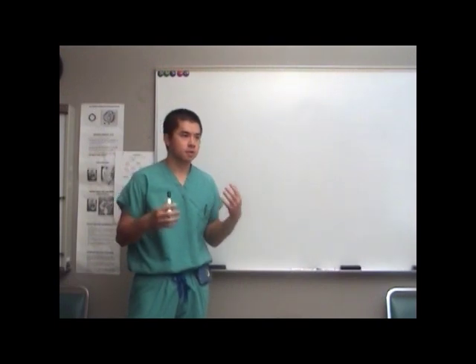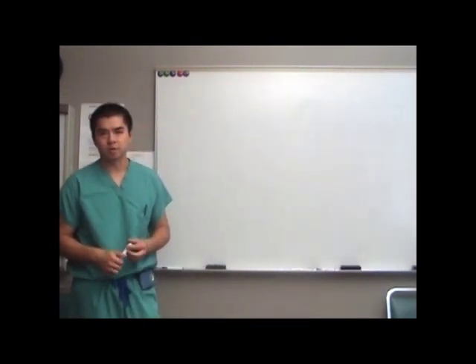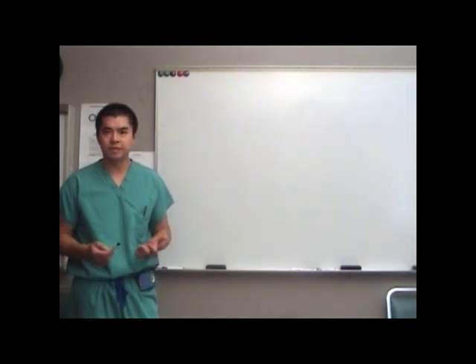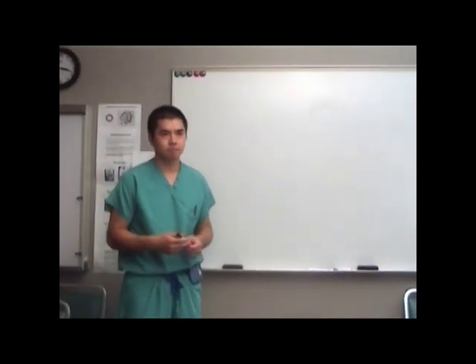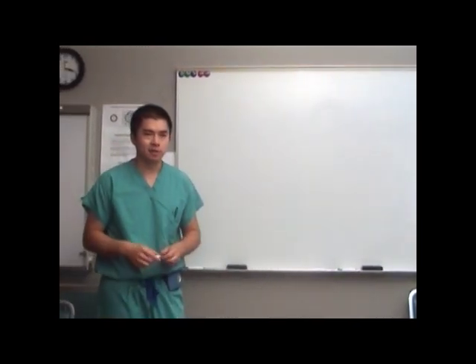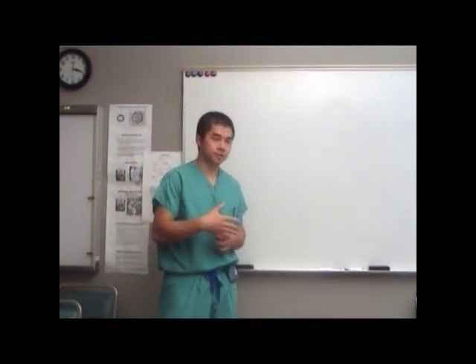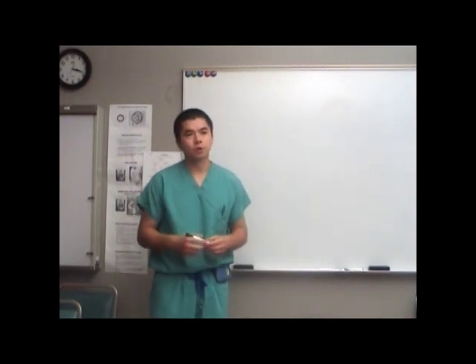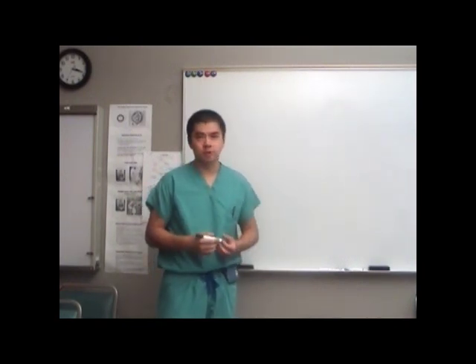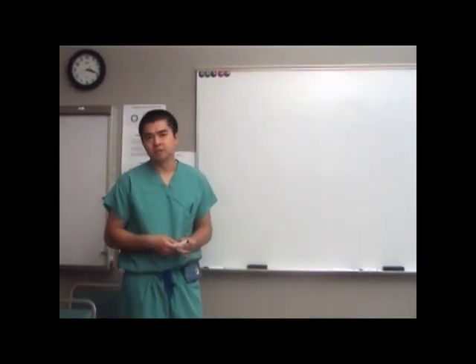So does it decrease mortality or improve neonatal morbidity or mortality or maternal morbidity or mortality? That's right, it doesn't at all. The only thing it's been shown to do is decrease neonatal seizure rate in the short term, but in the long term, there's no difference. So the only thing that it does, again, is increase your C-section rate. So why do we do it? That's right, it's just because we've always done it. It's the standard of care.